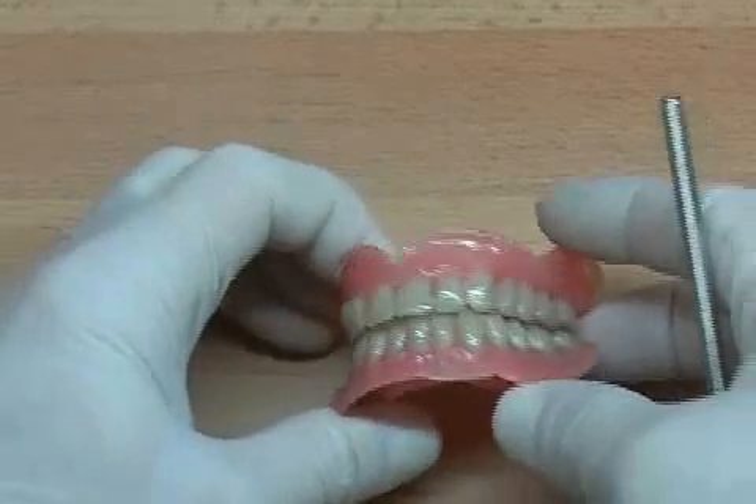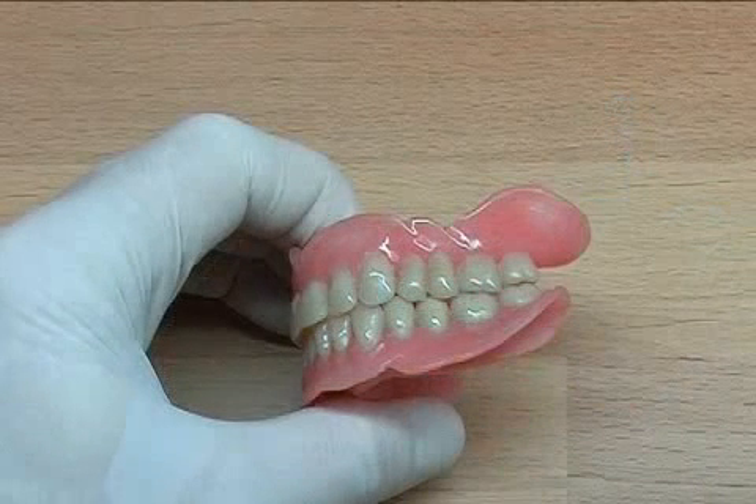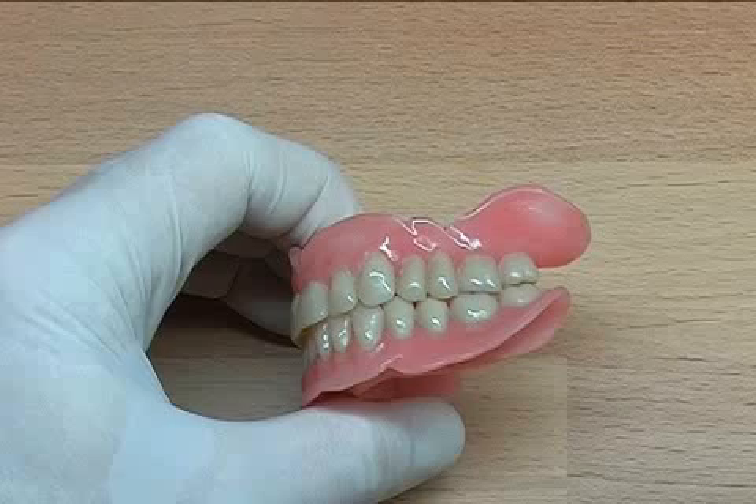Hybrid prosthesis is the name used for a detachable denture. The hybrid prosthesis is similar to the total prosthesis in terms of looks, but the hybrid prosthesis is anchored on the teeth and implants.